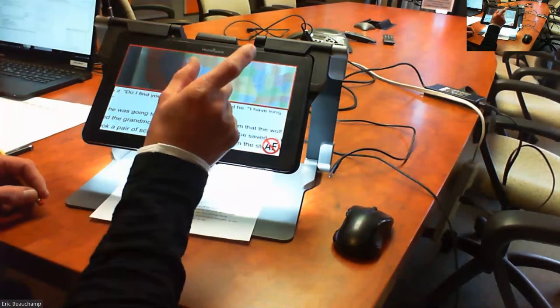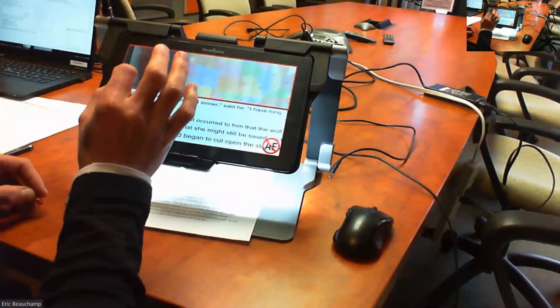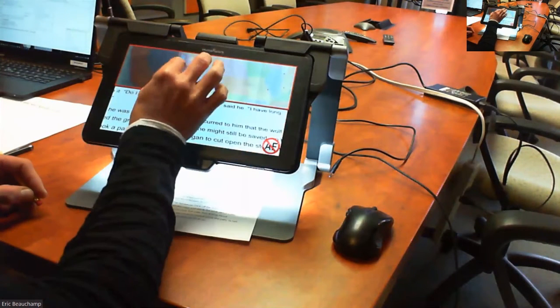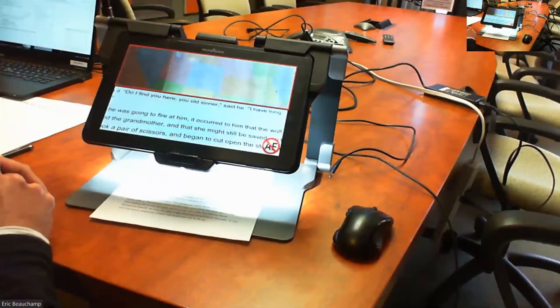But the zoom in, when you do a pinch and zoom for the distance camera, it's going to zoom in by one increment, and that's all. So you just do one gesture, it's going to zoom in a bit. Again, zoom in a bit. If you want to go quicker, then change to the distance mode.